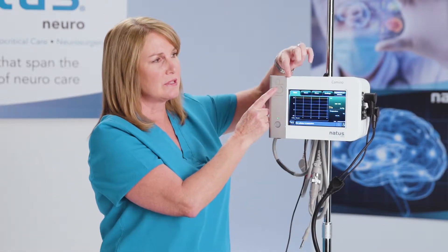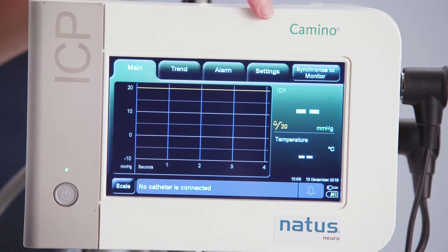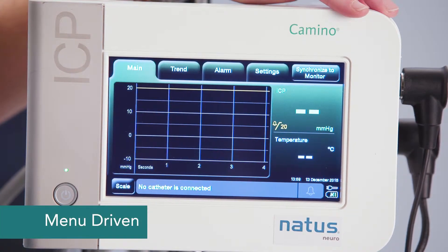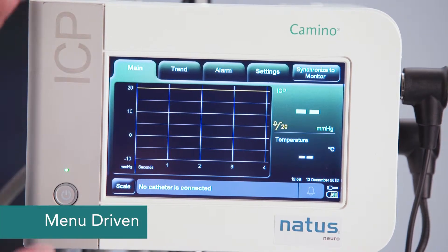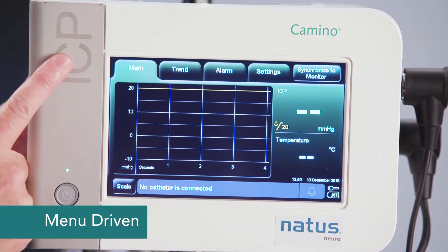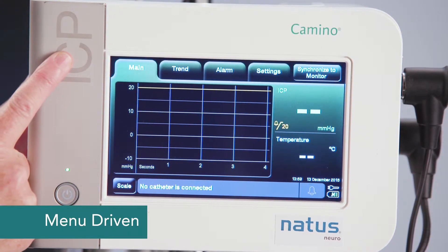Now let's walk through the functions of the Kamino monitor. There are five tabs across the top and it's completely menu driven. The main tab is where you'll spend the majority of your time.